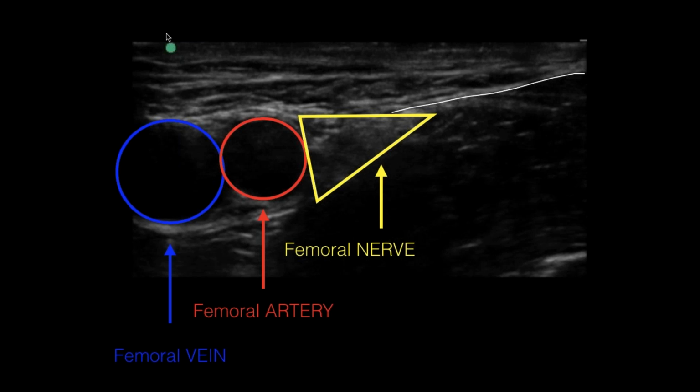to the femoral artery. And I'm going to point out here the overlying fascial layer that is superficial to the femoral nerve and then tracks out horizontally there. It's kind of a bright white line that I'm going to show you in a couple different videos, and you're going to get pretty accustomed to seeing the more you do this. That is actually the target of this block, is to get under the fascia iliaca.